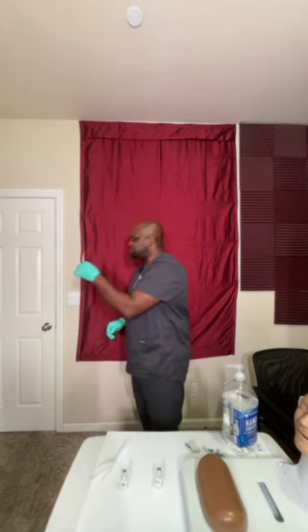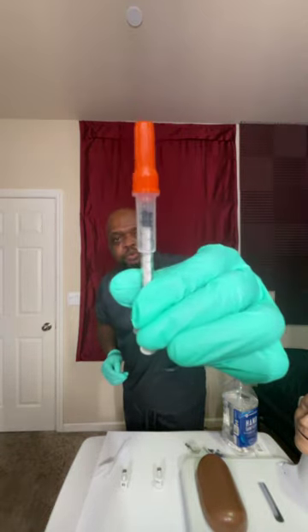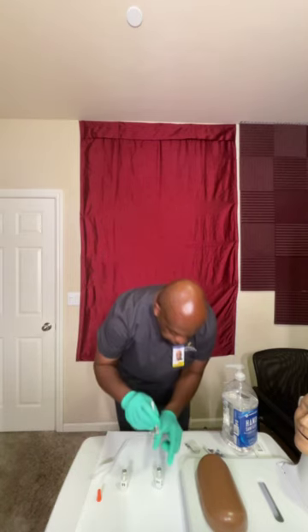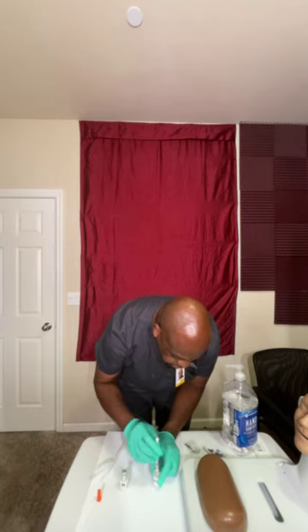So I just pulled up 8 units of air, right? 8 units of air. I'm going to let her see that. We are going to check it against the medication administration records. Now, from there, I'm going to also let you, the team on the other side of the camera, check the amount that I pulled up, right? So that's 8 units of air, right? I'm going to remove the cap. And this 8 units of air is actually going to go right into the bottle of the NPH. I'm going to press on the syringe, inject the 8 units of air.